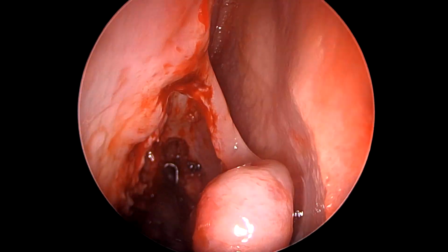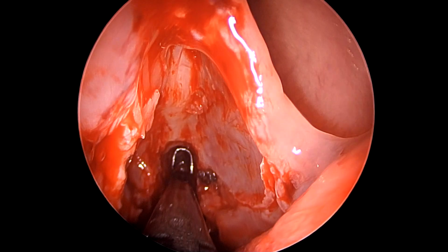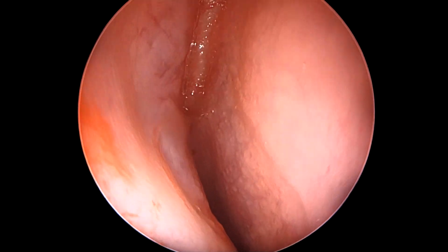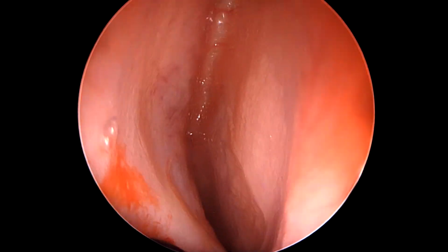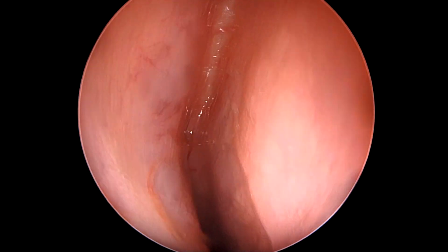And sometimes, in a patient with a thick beak and altered anatomy, this beak has to be removed either with the drill or with an articulated punch, depending on individual anatomy and equipment. So here we are choosing an articulated punch to clear some more frontal beak anteriorly, so that we are able to enter the frontal sinus proper, which we still have not.